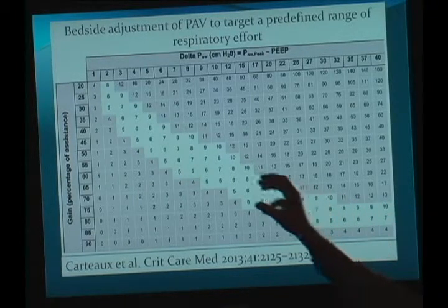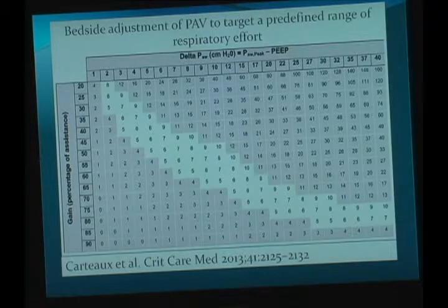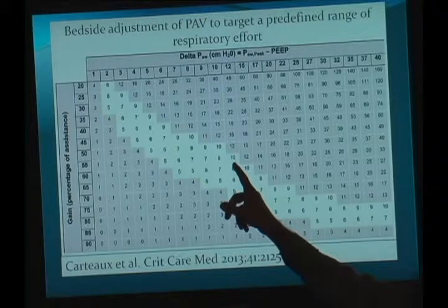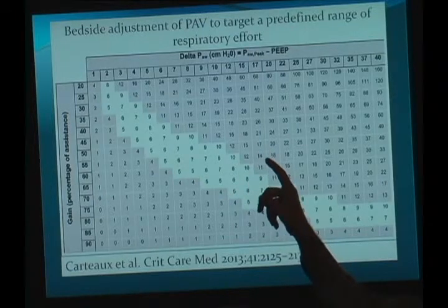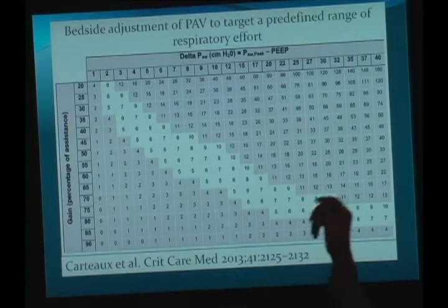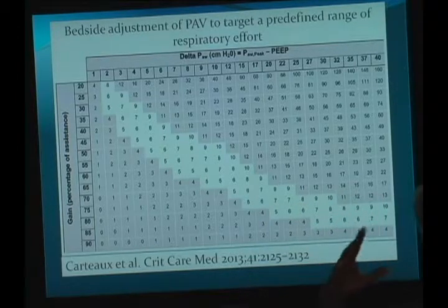They say it this way, but again, it doesn't compensate for the fact that 10 centimeters of water can be sustainable for you and me, but maybe it's too exhausting for a very weak patient. So always you need to put clinical sense in all of that.